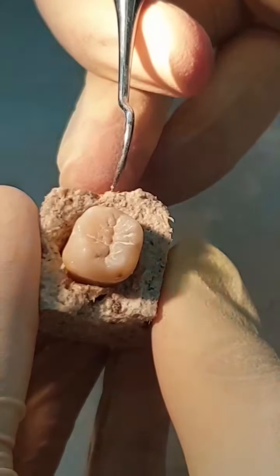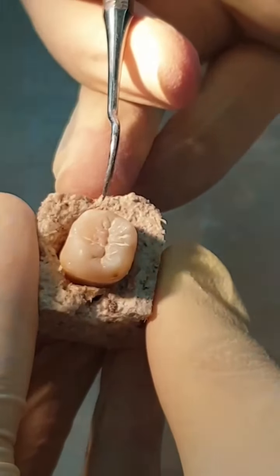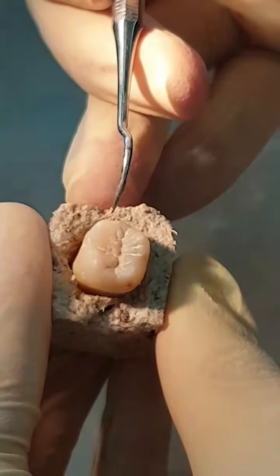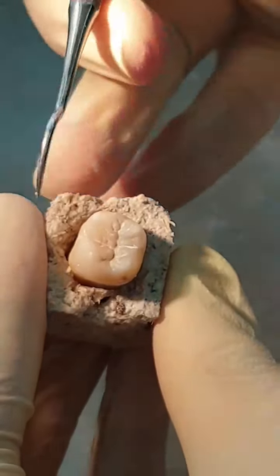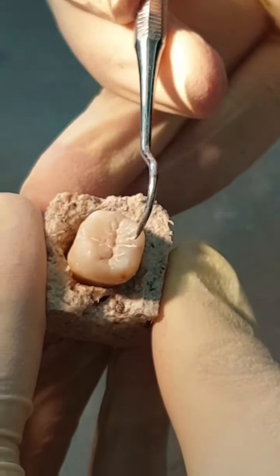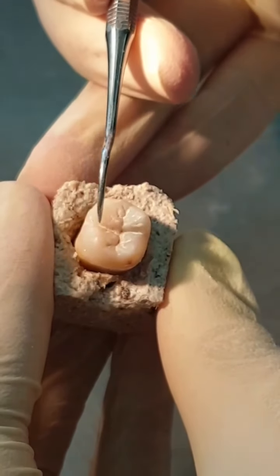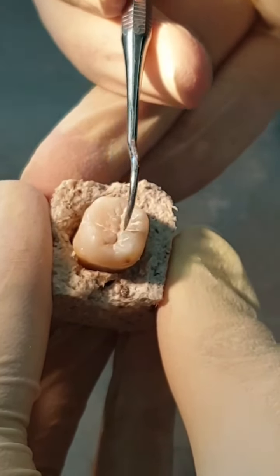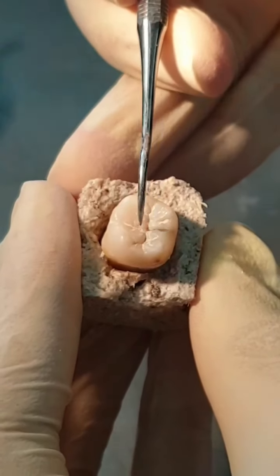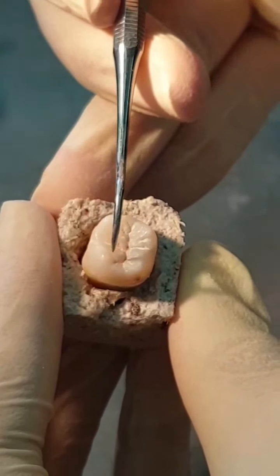Our entry point in this tooth is between two lines. The first line is the line that connects the mesiobuccal and mesiolingual cusp tips, as I am going to show you now. And the second line is a line that connects buccal and lingual grooves. So the entry point is between these lines, on central groove. And most of our access cavity is on the mesial side, not the distal, as I'm showing you now.